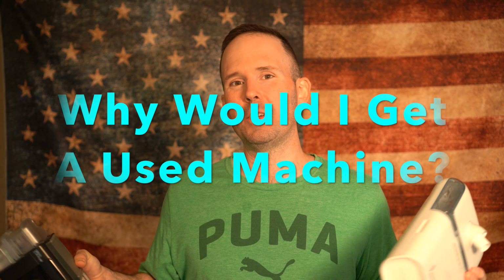The first question is, why would I get a used machine if I'm going through my insurance company, or through a national company? How could I possibly end up with a used machine? And the answer is because the national compliance average is only 50%. So the people who are non-compliant on CPAP either have to pay out of pocket or they have to return the machine. And at our facility, maybe a third of the people we set up are returning the machines.